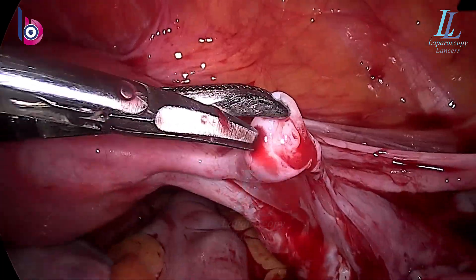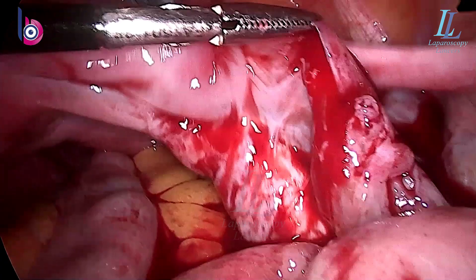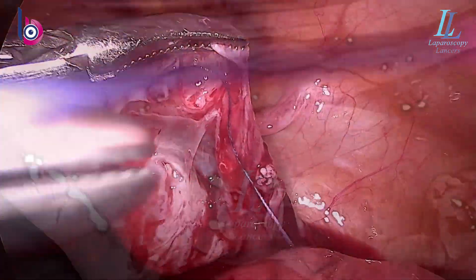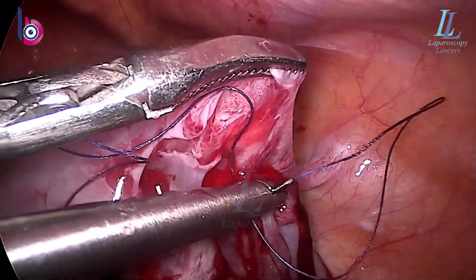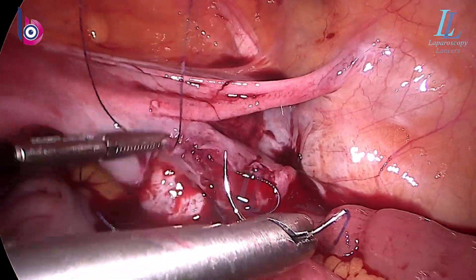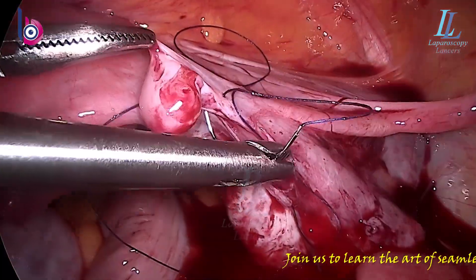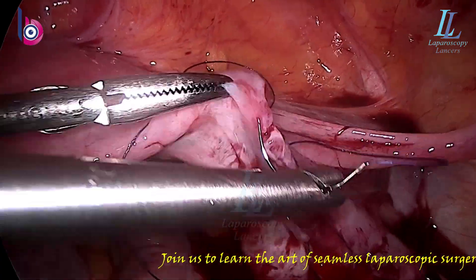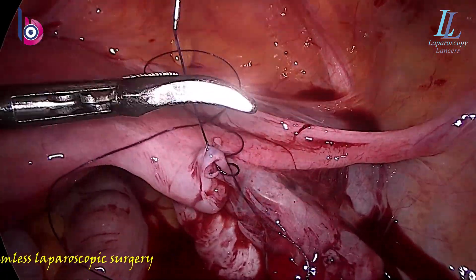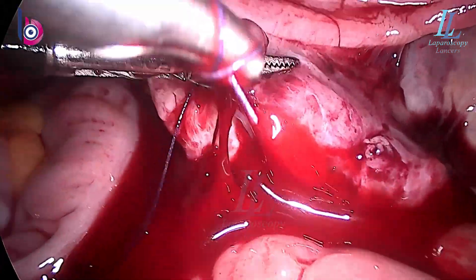The opening looks nice; the mucosal lining looks nice. Earlier we used to put a prolene suture through the uterus into the fallopian tubes to mark the structures and do a chromotubation after dividing. In such cases, the role of chromotubation or putting in a number one prolene is not a good practice, as they tend to injure tissue and initiate granuloma formation. Success rates may come down, and we gain nothing after those chromotubations — the tubes are actually open as shown in the SSG/HSG done earlier.